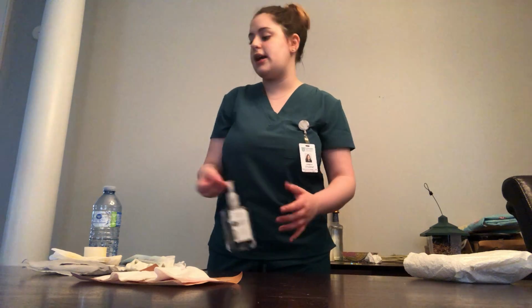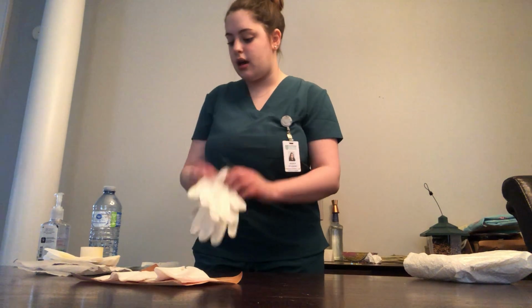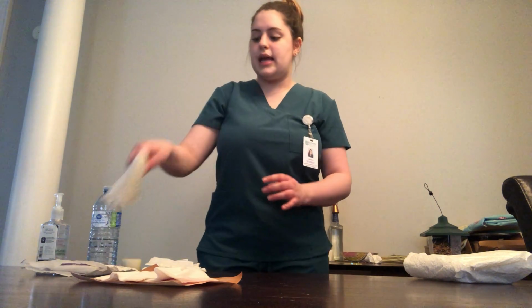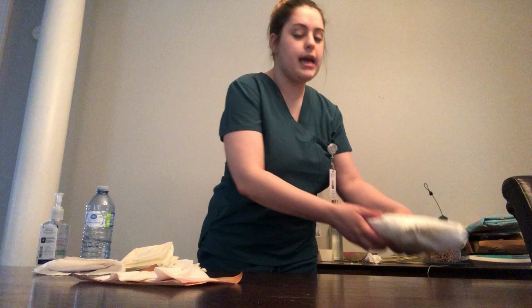Once I've done that, I'm gonna wash my hands and gather my proper supplies. So I have some hand sanitizer right here. Wash my hands. And get my supplies. So today we are using a pair of clean gloves. I'm using two 2x2 gauze. Usually I would use 4x4, but I don't have any in my lab kit, so we're using 2x2. A roll of tape and a pair of sterile gloves, a 5x9 abdominal pad, my normal saline, and a sterile dressing tray.